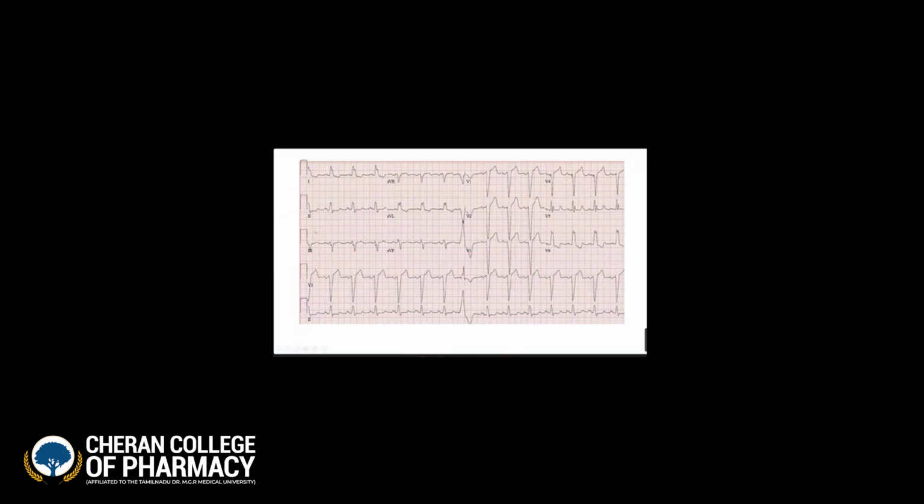So here, if we are checking lead 2, as you can see, the P wave is here. Is any kind of abnormality noticed by you guys? There is an M-shaped notch here, right? This is the M-shaped notch. M-shaped pattern. So it is clearly indicating that the patient is suffering from left atrial enlargement. This means that there is some sort of valvular dysfunction here in the patient's ECG.